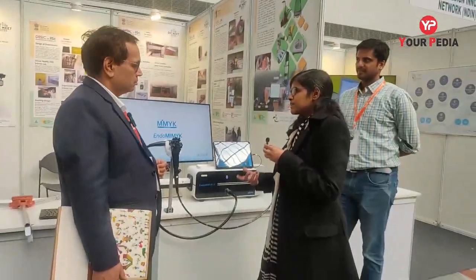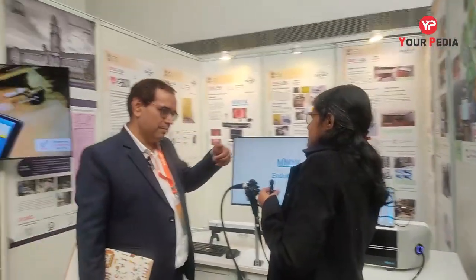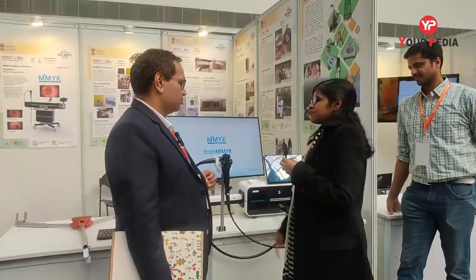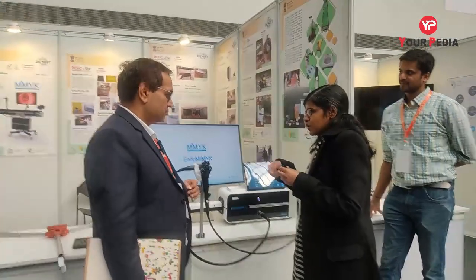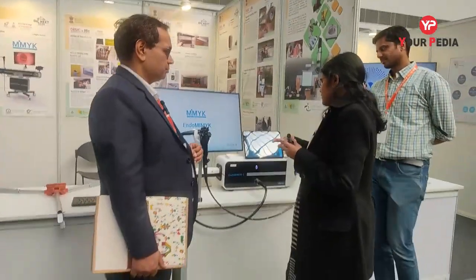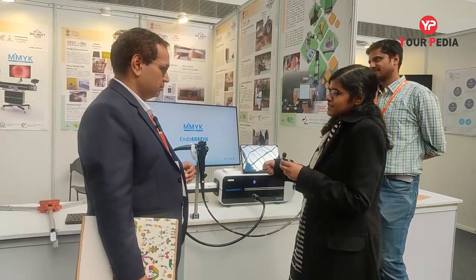Yes. Doctors can otherwise perform only on real patients. So this gives you a simulated environment to practice how to use the endoscopy device. You are saying this is helpful for medical students? Yes, they can practice without any actual human. Correct. It also gives haptic feedback: if you navigate and poke on the lining, you get the pressure force feedback, as in real life. So the core technology has the haptic part to it. It is very close to reality simulation.